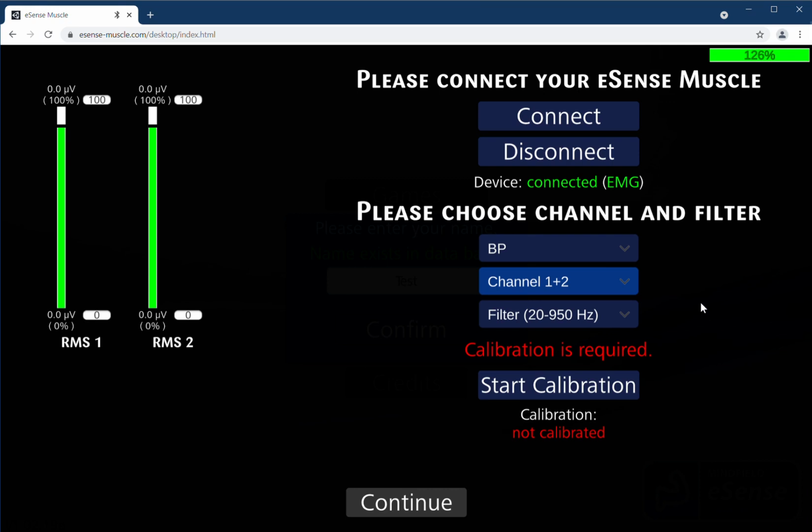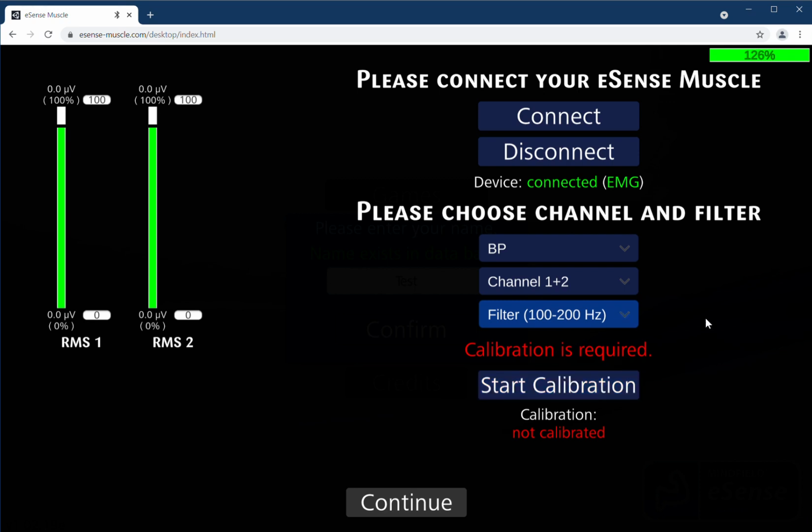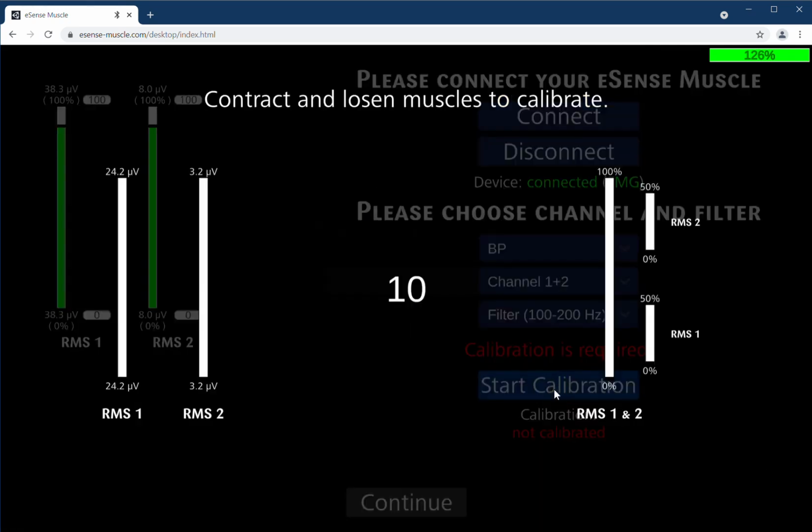So then I have here the setting of 3 different filters. That's a common thing for muscle recordings. You can choose one wide range filter, 20 to 950, or some more narrow bandpass filters. I choose the 100 to 200, the most narrow filter here, and then it says calibration is required. Calibration means just start that, contract the muscle and loosen the muscles to calibrate.